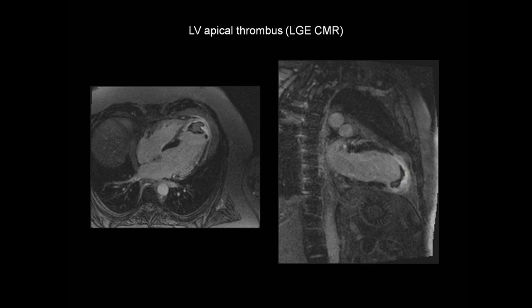The thrombus can be seen much more clearly on these images than on the previous cine images. That's because thrombus is avascular, which makes it dark — it doesn't take up any gadolinium contrast. So on these two images, we can see this dark, irregular structure at the apex, surrounded by the infarcted myocardium, which is very bright because of the presence of late gadolinium enhancement. Late gadolinium enhancement CMR is the most sensitive technique for identifying the presence of left ventricular thrombus.